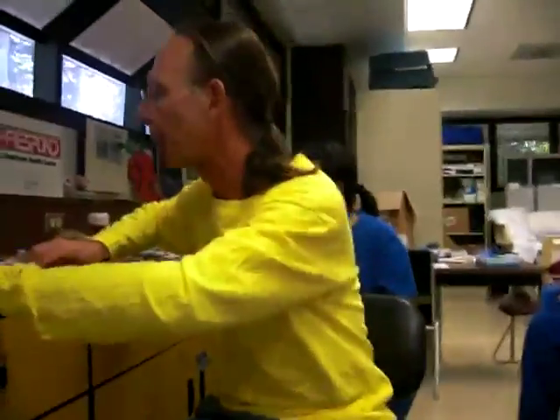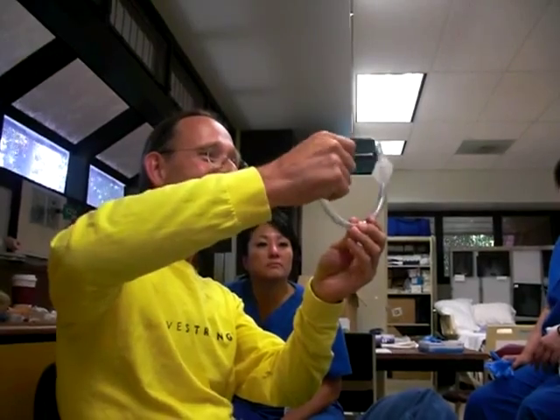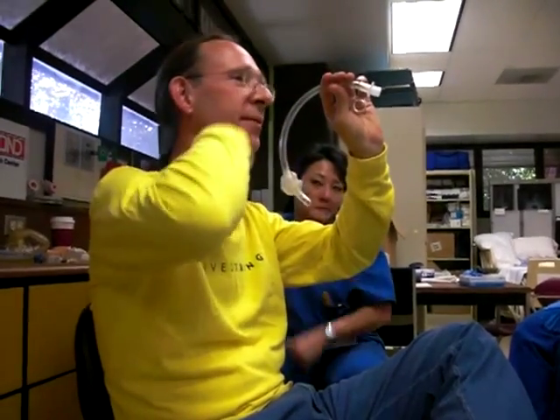Now there are some oddball endotracheal tubes. These we're going to try and recognize. This is for nasal, blind nasal intubations. It's called the Endotrol tube - it has a little ring on it. When you pull the little ring, the tip moves. The larynx is in the front, it's anterior. So you run this down your nose, and when you get it in the right place, you pull on this ring and it aims it in there. Because if it goes backwards, it goes in the esophagus. It's called the Endotrol tube - it's just a fishing line.